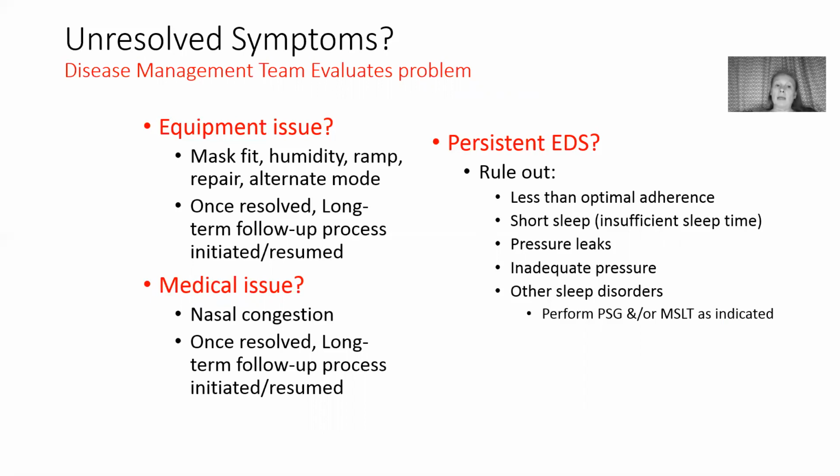Is it an equipment issue? Do they have a poorly fitting mask? Do they need humidity and so forth? Once resolved, the long-term follow-up process is initiated or resumed. Is it a medical issue? Do they have nasal congestion or something else going on, headaches? Again, once it's resolved, the long-term follow-up process is initiated and resumed.